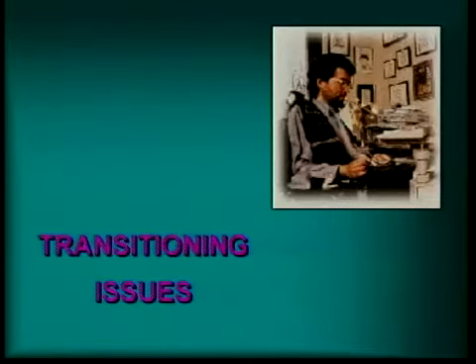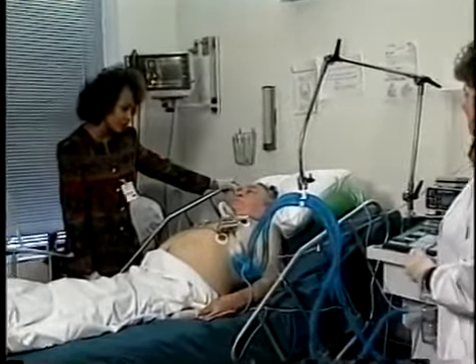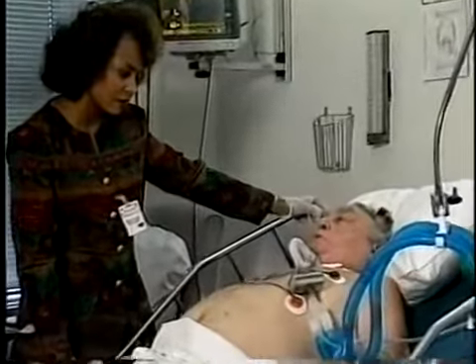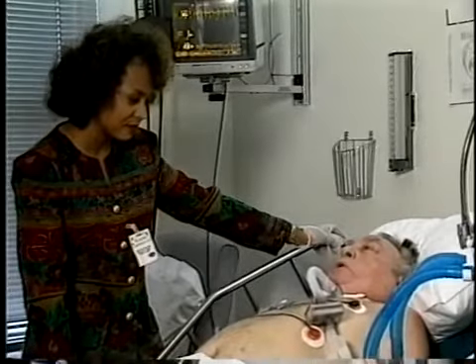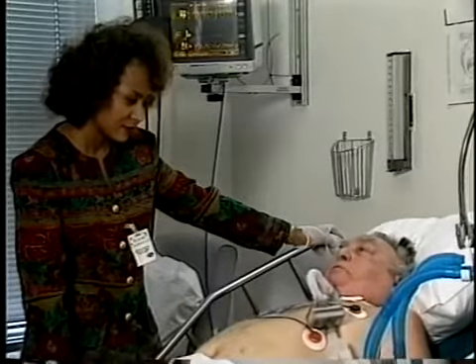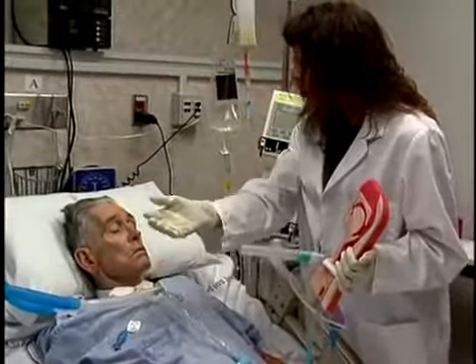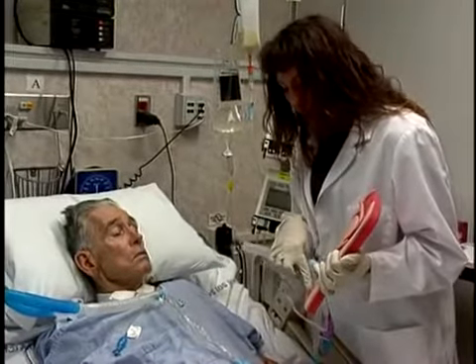Anxiety is a primary issue for ventilator patients. Patients who are mechanically ventilated for an extended period of time naturally become more anxious with any manipulation of their ventilator and tracheostomy tube. To reduce this anxiety, it is helpful to have the speech pathologist available to assist with transitioning. Educating the patient on the process of valve placement will decrease anxiety as well.